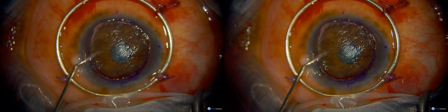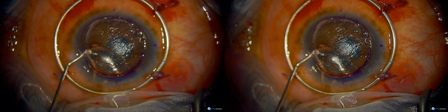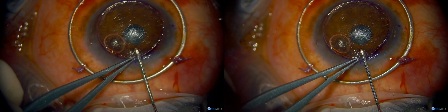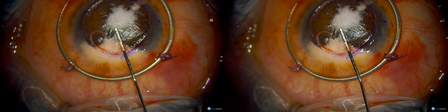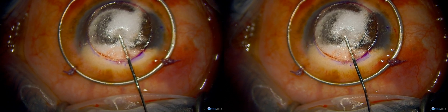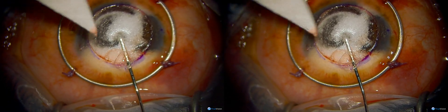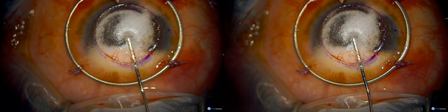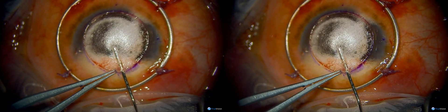Now she's going to attempt to remove some of the viscoelastic and inject some air in there. If there's air in the anterior chamber it aids you when you make the big bubble to make sure that you have bared Descemet's membrane and the bubble is still intact. Using a cannula she's injecting air now into the stroma, and it looks like we're getting a mixed bubble here — probably a type 2 at first, and there's an area of type 1 where she's touching with the Weck-Cel at this point, trying to get a little more peripheral extension of the dissection. Now removal of the cannula.